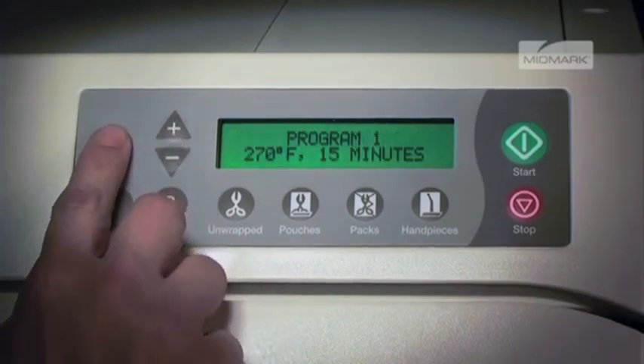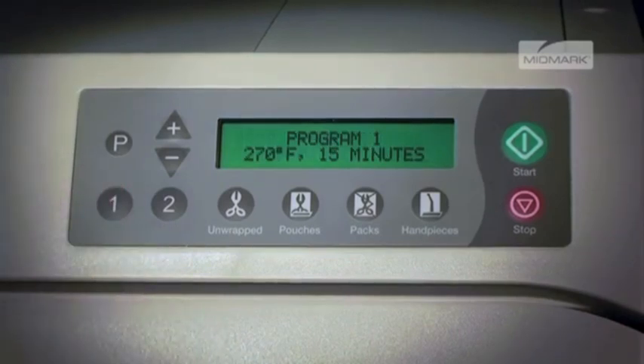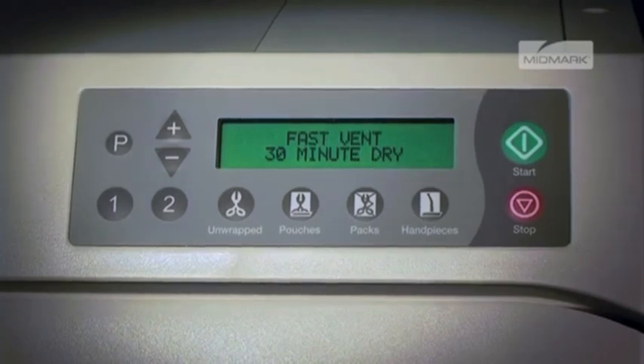Now, if you select the one button, the display will show the new parameters. These parameters will remain in memory until they are changed and will remain even if the sterilizer has the power turned off by unplugging.